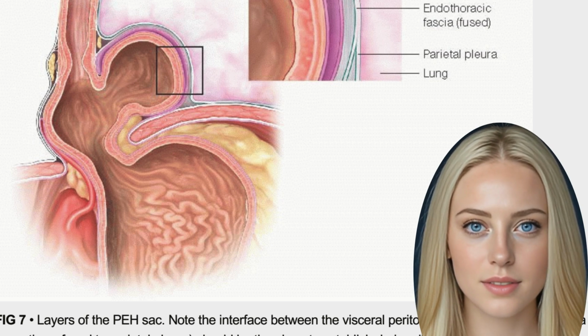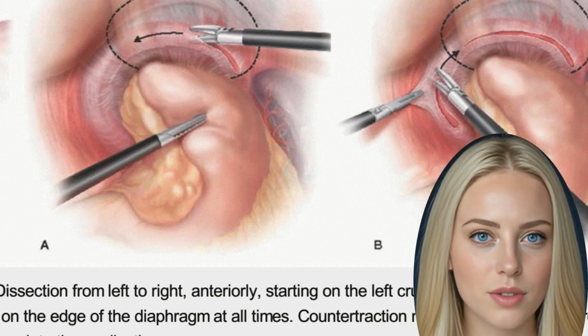1. An 11 mm supraumbilical camera port, offset just to the left of the midline and 15 cm inferiorly. 2. A 12 mm left upper quadrant port, measured 12 cm along the parallel line to the left costal margin, for the surgeon's right hand. This port is placed 1 to 2 cm inferiorly to the 12 cm mark.